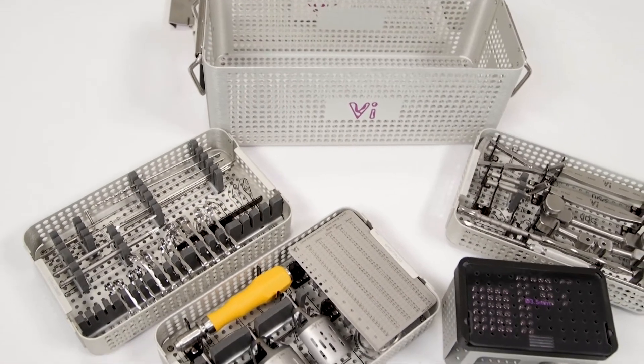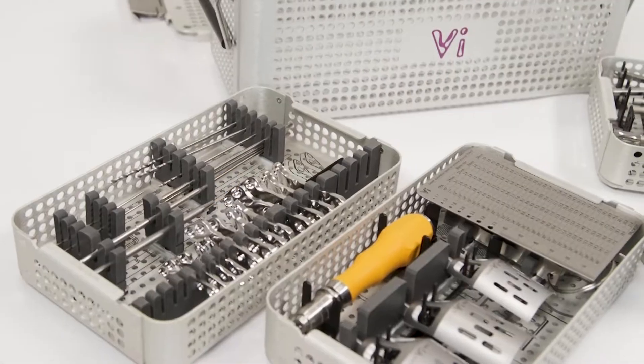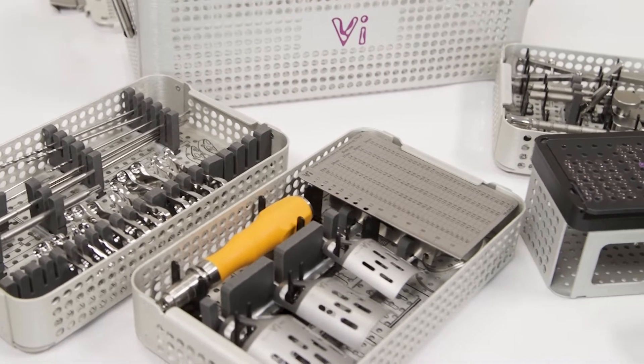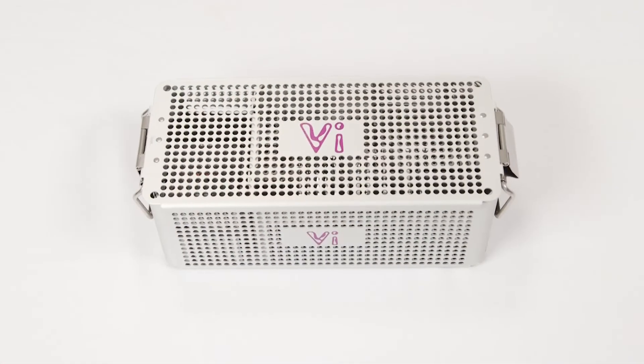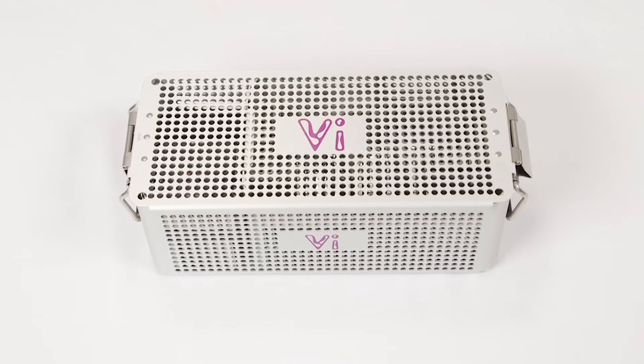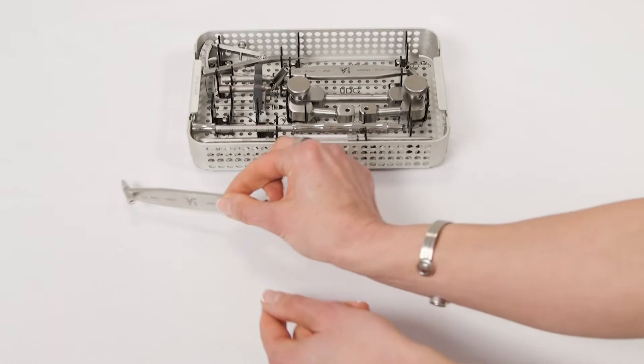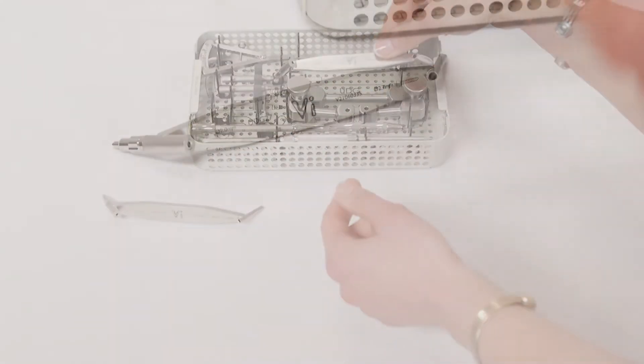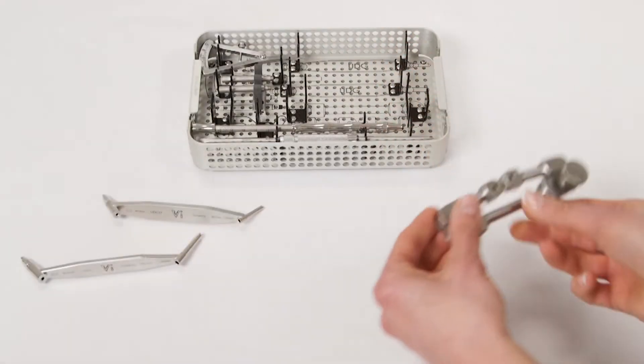The Instrument and Device Trays contain all the equipment typically required when performing a TPLO using the VIL TPLO locking plate. The contents of the kit are comprehensive for this procedure and include the Universal Drill Guide in both sizes and a TPLO Jig.